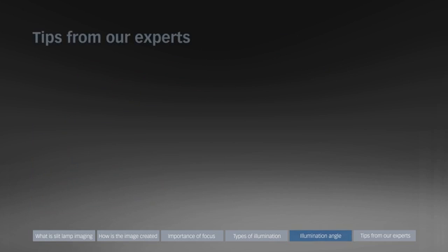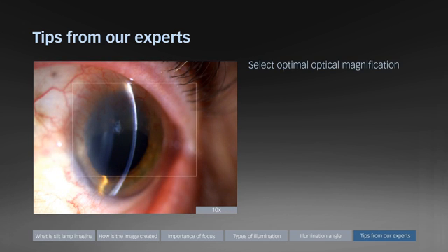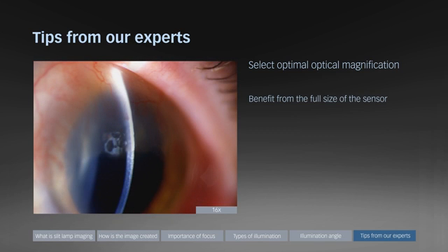This last section provides a number of general imaging tips from our experts. First of all, select optimal optical magnification. This way you benefit from the full size of the camera sensor.